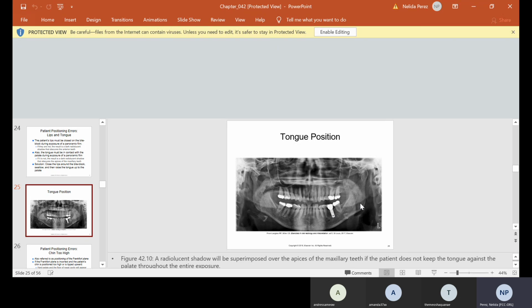As far as everything else, pretty much everything else, doc is the one that diagnoses. He's the one that checks for cavities. He's the one that checks for cysts and abscesses and things like that. You may see it, but remember, we as dental assistants do not diagnose. These here are very good sinuses. You can see it really good. And over here, you can see the TMJ, real nice. Okay, nice jaw, and then the TMJ.